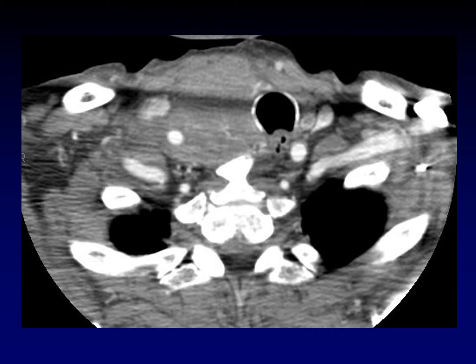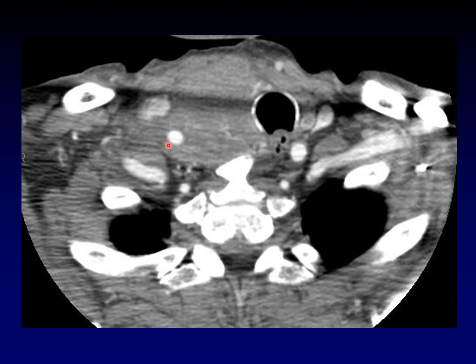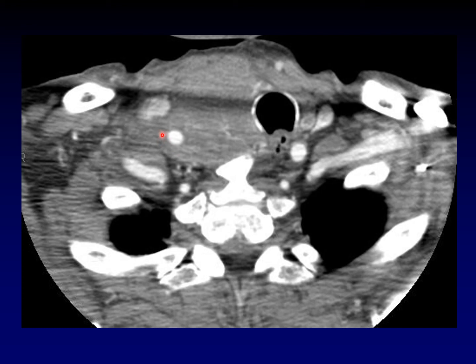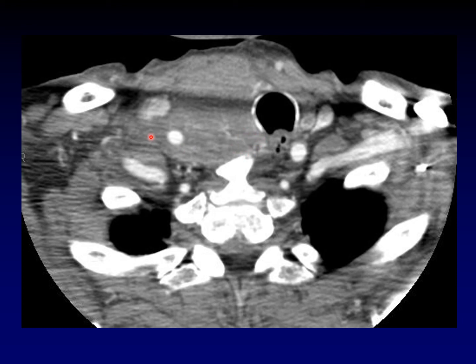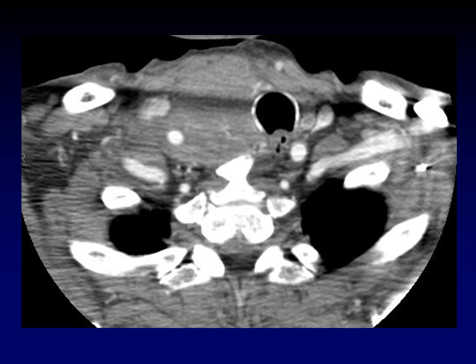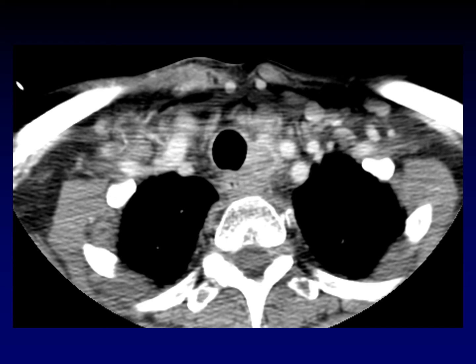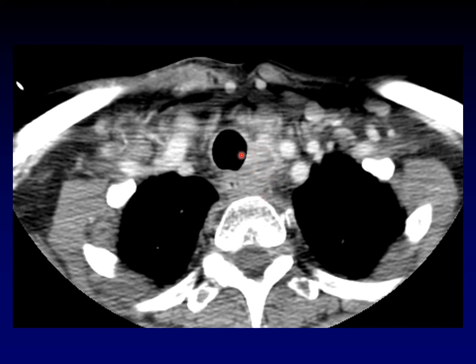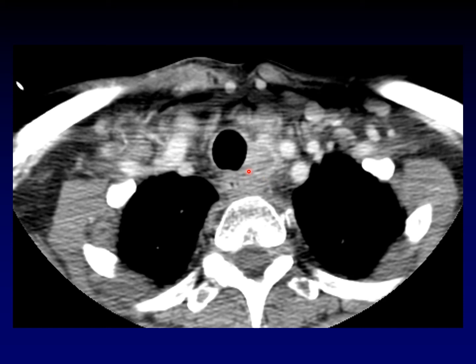Here's a mass in the lower right neck with a very aggressive appearance, encasing the common carotid artery. The vagus nerve runs right there between the carotid artery and the jugular vein, and the recurrent laryngeal nerve runs in the tracheoesophageal groove, so either location might be responsible for vocal cord paralysis. Here's another example: an enhancing mass filling the left tracheoesophageal groove, right along the expected course of the recurrent laryngeal nerve.